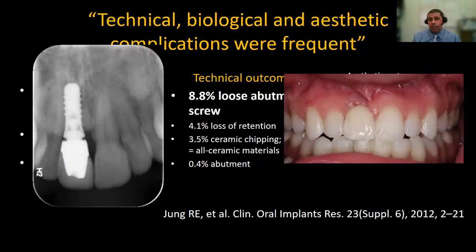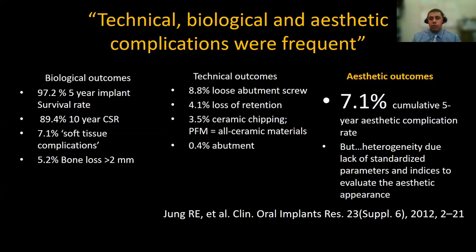But that's something that can happen, and similar to what you see in this picture with the abutment being loose, it can result in aesthetic problems, biological problems, and soft tissue inflammation around the implant. So we have to be very careful and do everything we can to actually have a very stable connection, and that stable connection to be there and stable over time.